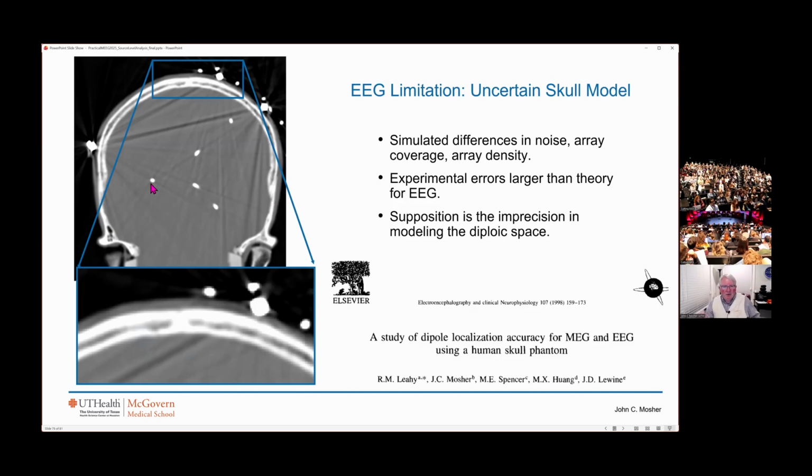The modeling of the skull is still today a bit of a nightmare. We need millimeter-sized triangles, and we're still just not quite there. And this is for a normal head. You do a patient that's had holes drilled, and now you've got breaks and burrs and holes in there. So our supposition is the imprecision of the modeling of the diploic space, and that's still a problem today.